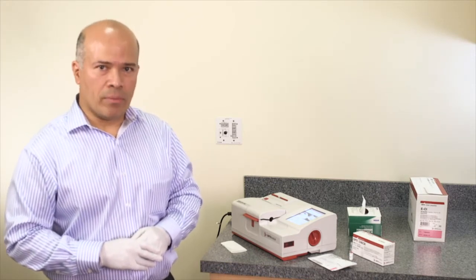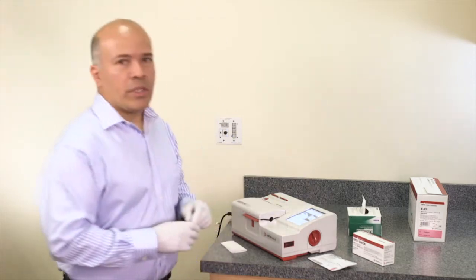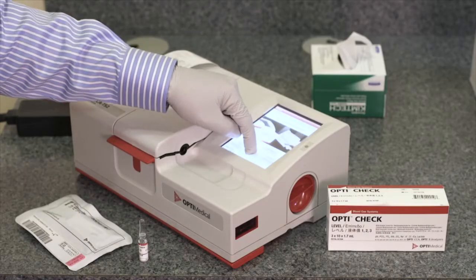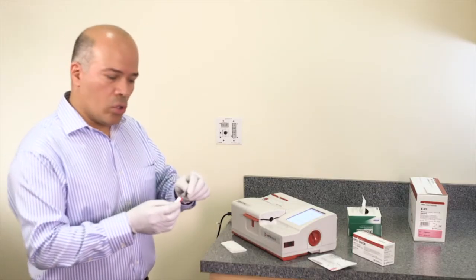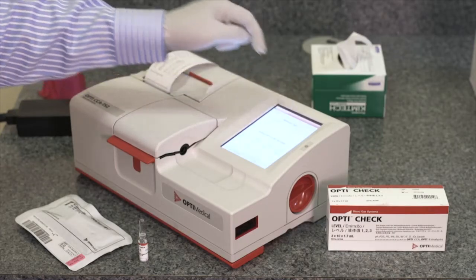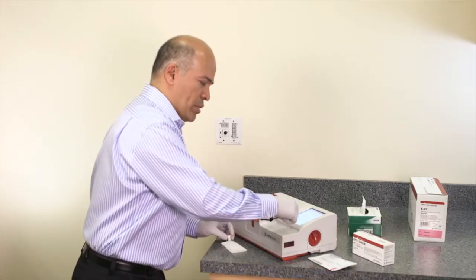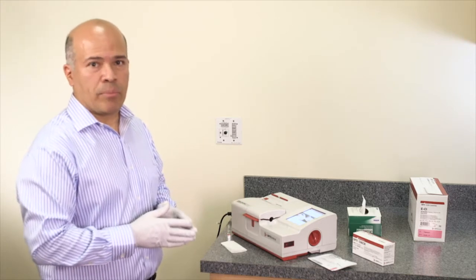Opti recommends running the liquid control once a month. To run the liquid control, go to the Quality menu and select the ampoule level needed to run the control: Level 1, Level 2, or Level 3. Once the level is selected, press OK. The instrument then instructs to scan the cassette barcode.